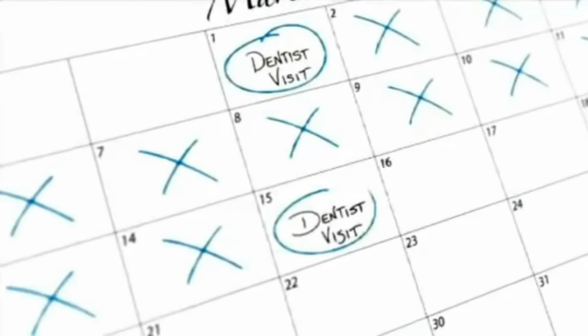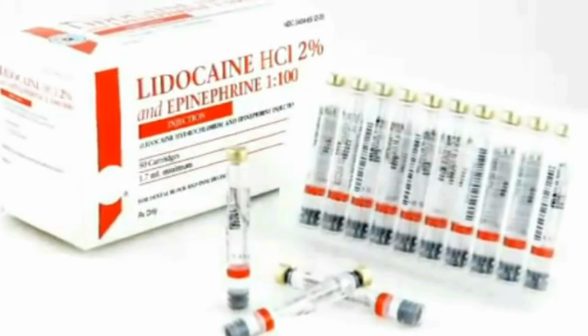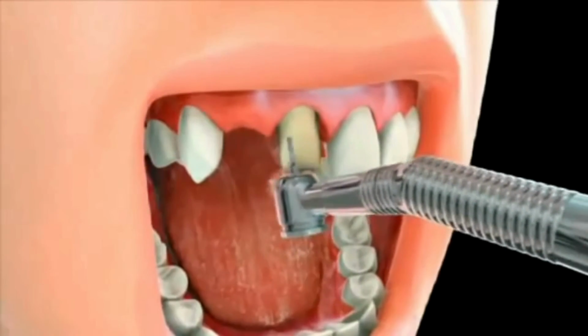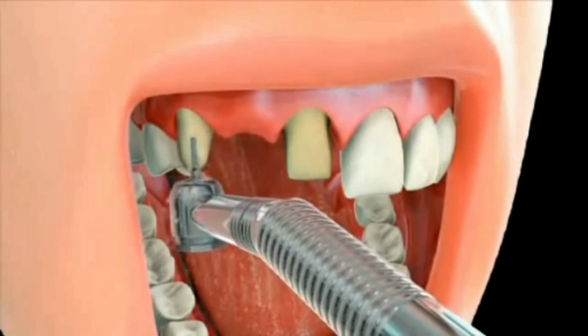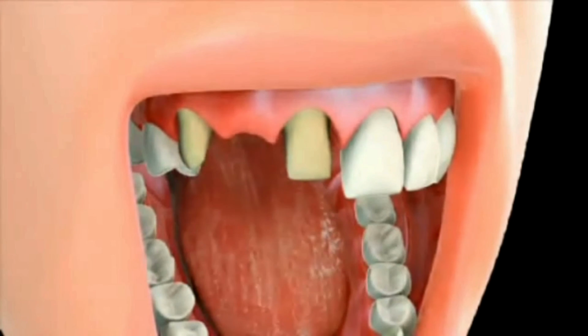On your first visit, a local anesthetic is administered to make the procedure more comfortable. During this visit, the supporting teeth, which are typically the ones on either side of the missing tooth, are prepared by shaping and reducing their size. This is done to make room for the crowns that will slide over each of the supporting teeth. These crowns also serve as holders of the pontic, which is the missing tooth's replacement.